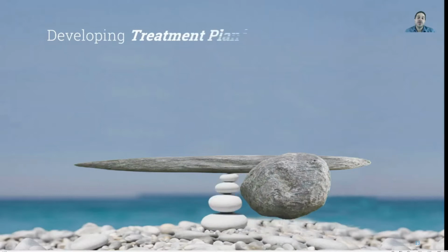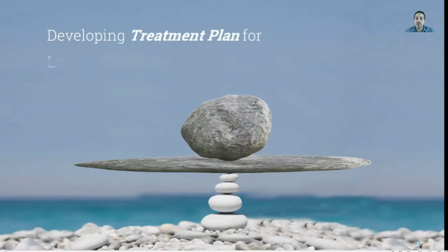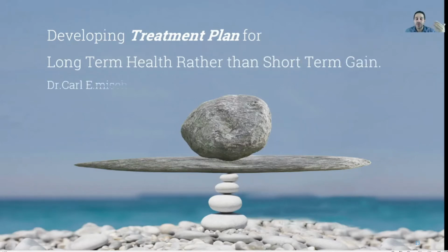So we are the online generation where everything is single touch away from us. Our patients will come to our clinic looking for a treatment with their expectation: high quality treatment in short time and less cost. And for us to be able to give the proper treatment for our patient from aesthetic wise, function and longevity as well, we need a tool, a way to communicate with our patient, plan our cases, show them the final outcome, and get the final approval and increase the patient acceptance.